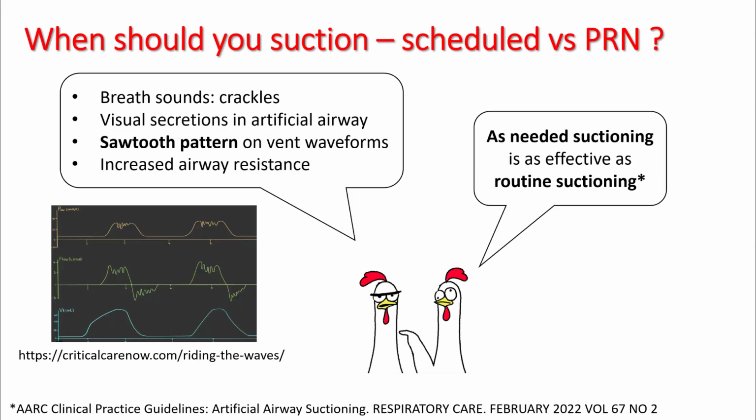So first question, when should you suction? Studies have found that as needed suctioning is as effective as routine suctioning. So whenever you hear crackles in your breaths and you think that there are secretions fluttering in the airway, if there are visual secretion in artificial airway, if you see sawtooth pattern on vent waveform or find signs of increased airway resistance, you should go ahead and suction.